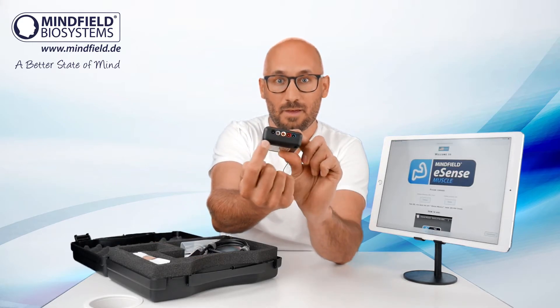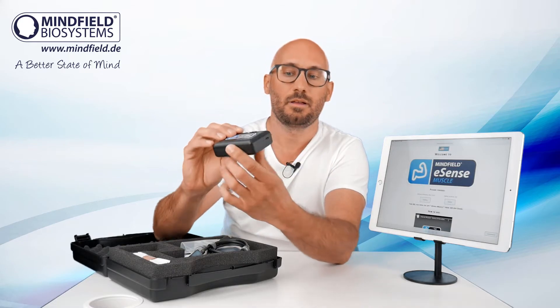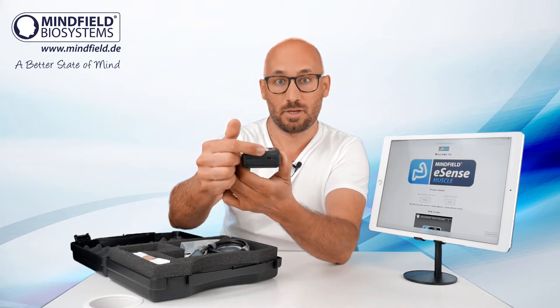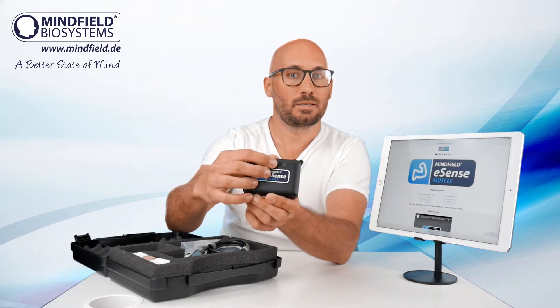You have five electrodes to connect here, making two channels and a ground electrode. You have the connection for the USB-C cable for charging, and there are two buttons and an LED.